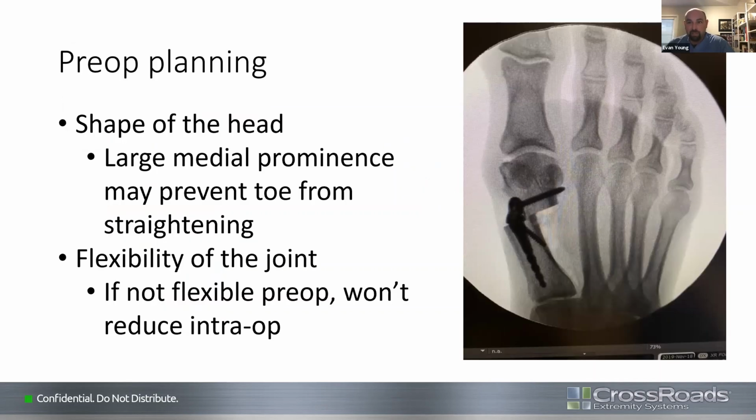So basically, I'm just going to expand on everything Dr. Lamm had been discussing. First and foremost, you definitely don't want to do the wrong procedure at any point in time. So, the mini bunion, as wonderful as it has been for me, and I've probably done somewhere around 60 to 70 of these at this point, I've run into a few small issues from time to time, and I think just passing along the things that I've run into is sort of the key.